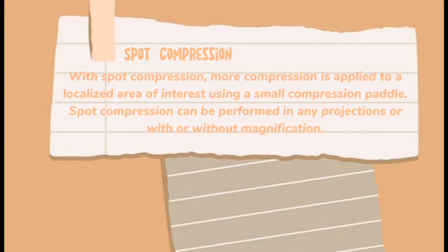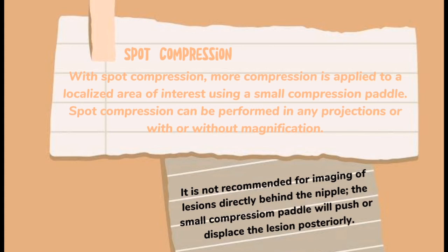Spot compression. With spot compression, more compression is applied to a localized area of interest using a small compression paddle. Spot compression can be performed in any projection, with or without magnification. It is not recommended for imaging of lesions directly behind the nipple. The small compression paddle will push or displace the lesion posteriorly.